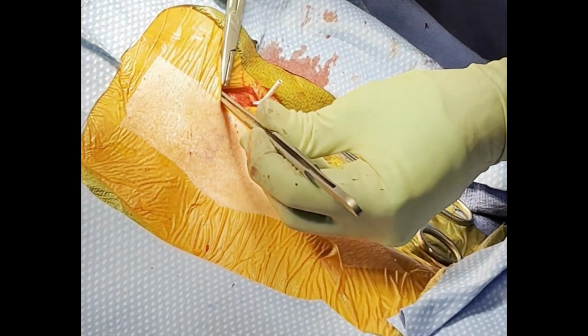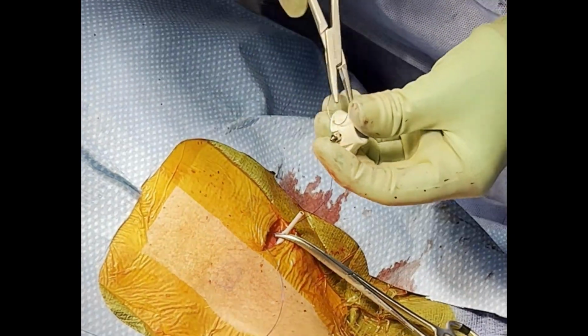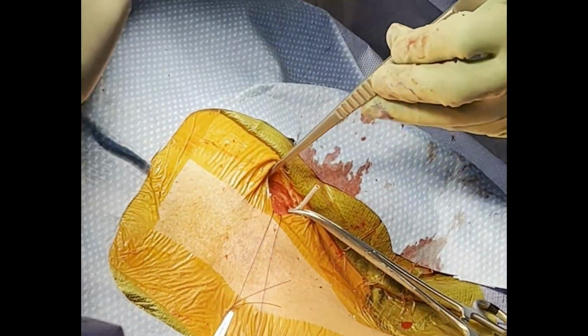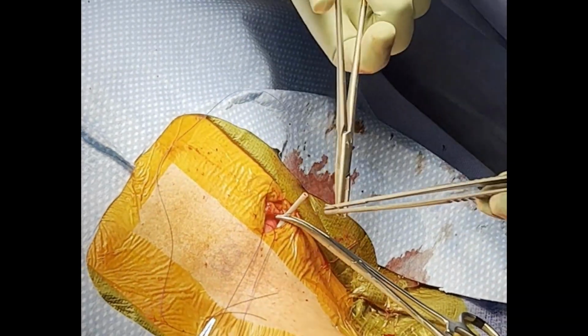Now it is time to insert the port itself. Put a suture through the chest wall, then through the port. Once the sutures are through the port, remove the needles and secure the sutures in place without tying them.